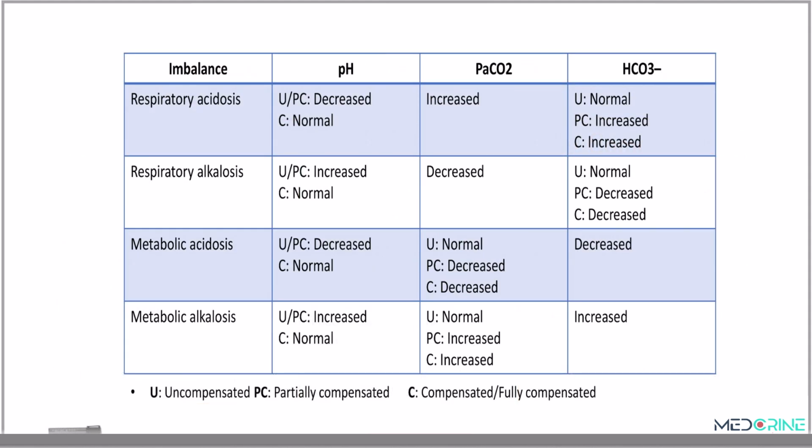You can pause the video for a moment and have a look at this table. Try to identify the relationships between the compensated, uncompensated, and partially compensated states of each of the four acid-base balance disorders.